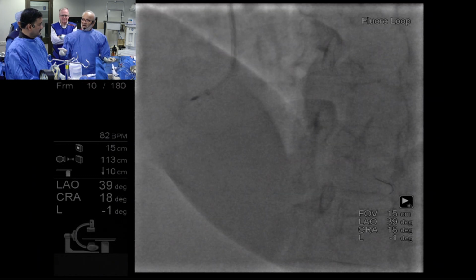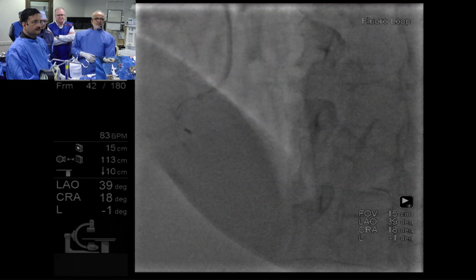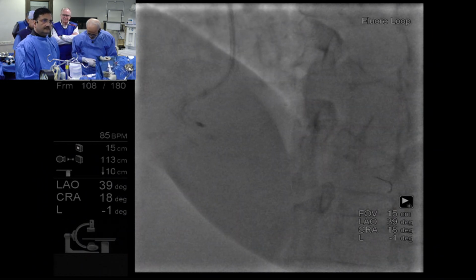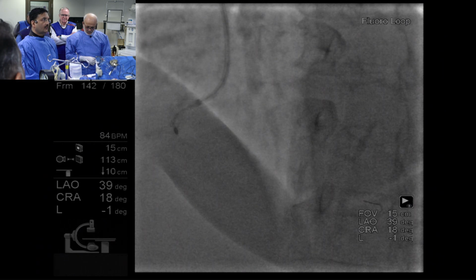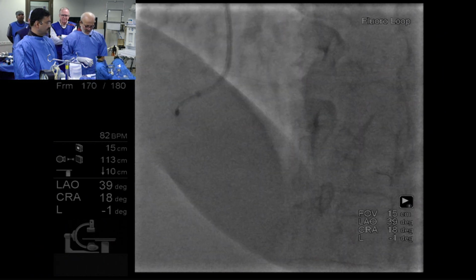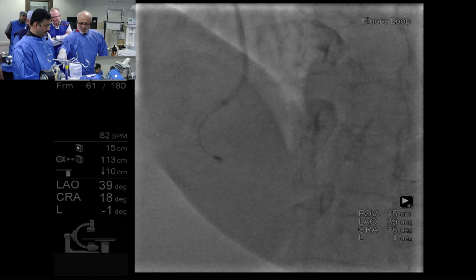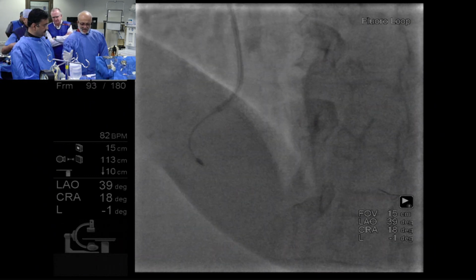And one more pass and we will go distally. Tejas, when you go distally, if you could, for the fellows, explain what you're doing, because distal rotor is a different skill. How to advance the whole system and press the brake off. That's the back, right? Maybe you could go through that. I was asking, Sanjay has a brake in his hand.